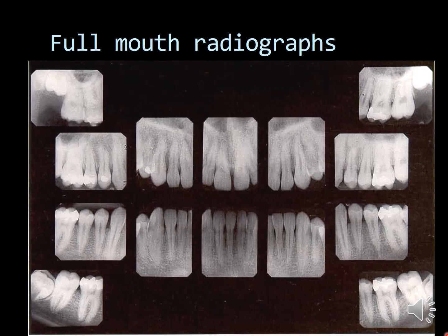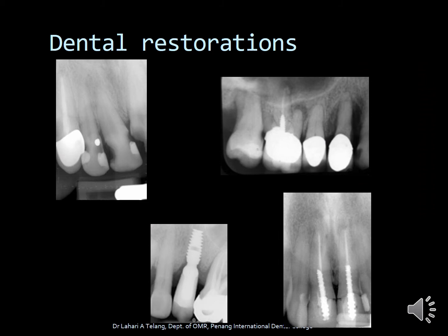That brings us to the end of all the maxillary and mandibular landmarks. When viewing full-mouth radiographs, you will be able to identify each landmark — though not all landmarks will be visible on every radiograph, the majority will be. When interpreting radiographs, it's important to understand that restorations cast different shadows. They are denser because of metal content, or less dense if made of composite. This radiograph shows a root canal treated tooth with a metal or PFM crown. You can also see implants and posts with root canal treatment.